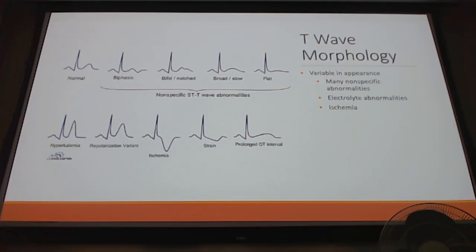Here's what we're more focused on today: we're looking at T waves, and we're looking for ischemia and infarction. And it's important because a lot of you guys probably look at it right now and you're like, man, all those T waves look the same. I don't even know what you're talking about. But this is kind of how it changes when we have ischemia, infarction, or some sort of non-specific ST-T wave abnormality, which is a very common thing we see.